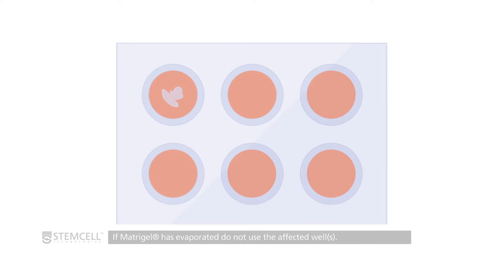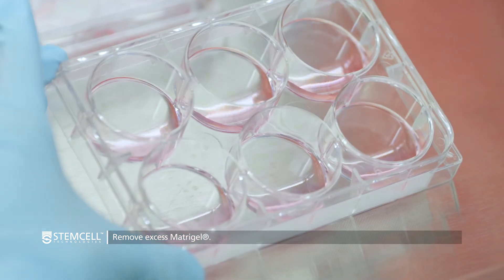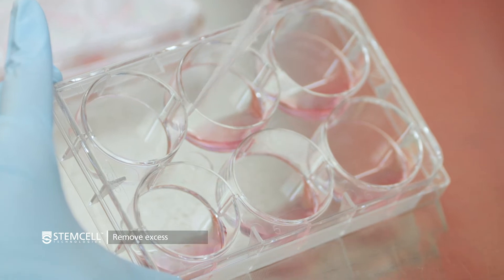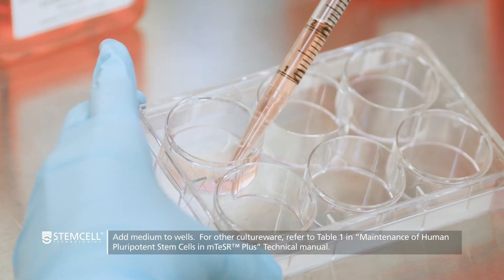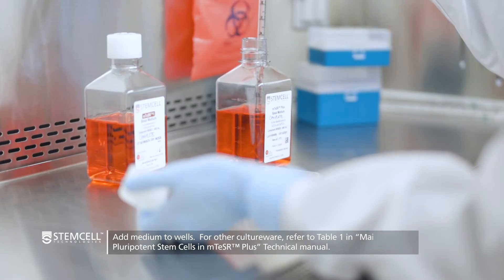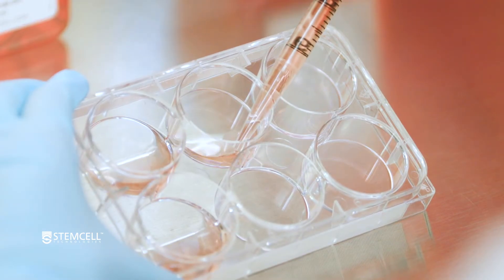If Matrigel has evaporated, do not use the affected wells. Now tilt the plate to the side and aspirate the excess Matrigel solution carefully, ensuring that the coated surface is not scratched with the pipette or tip. Immediately add 2 milliliters of appropriate medium to each well. If you are using other sized cultureware, volumes will have to be adjusted.